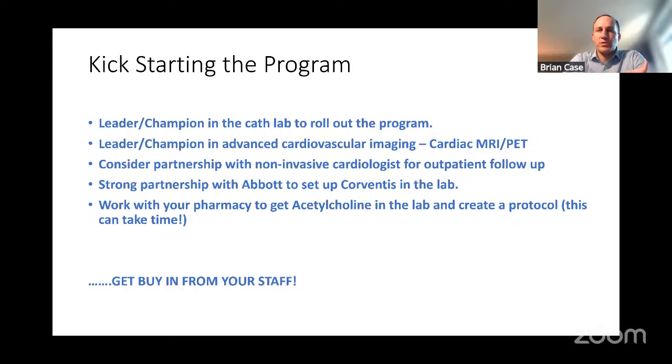When we do coronary functional testing, like a planned procedure, my team rolls out. They have everything ready. They have the adenosine ready. They have the acetylcholine ready to go if there's normal coronaries, and they have all the extra equipment that's needed to perform the thermal dilution technique.